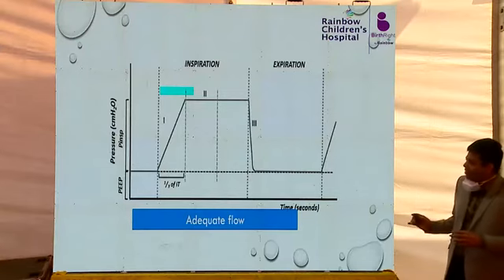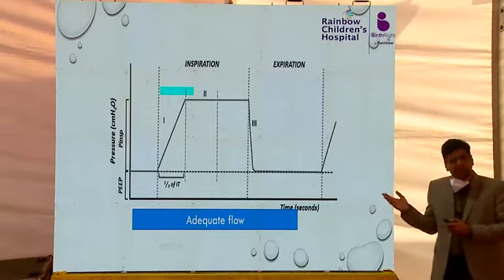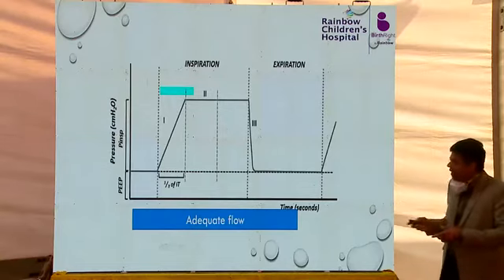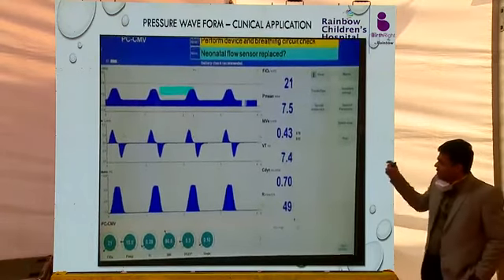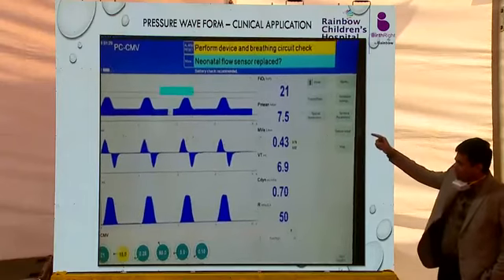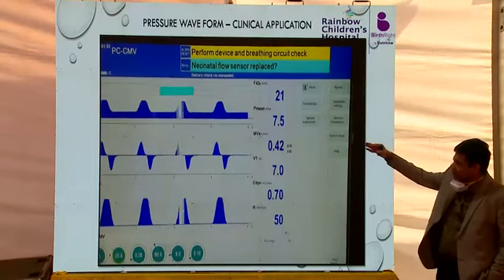So I haven't gone into too much depth on this. Sometimes you can even assess the synchronization also, but there are better waveforms to do that. So we will stick to that easier thing. I think the uppermost is the pressure, showing how the waveform is changing.